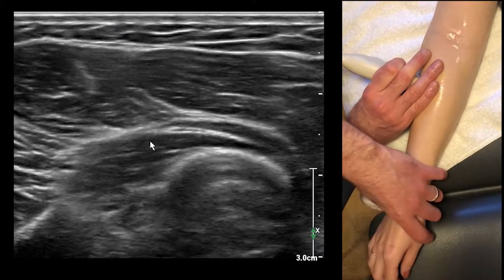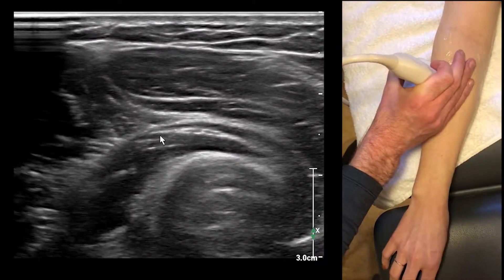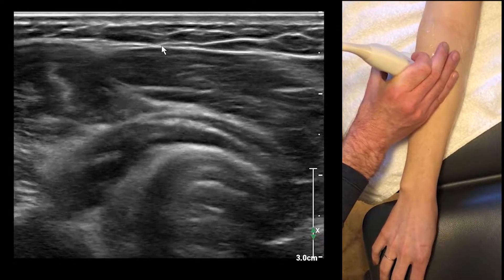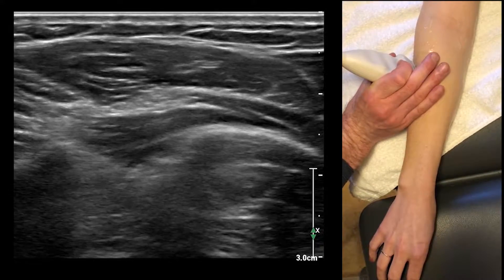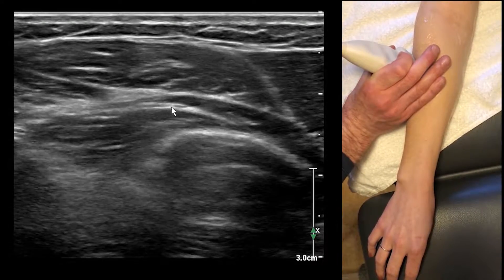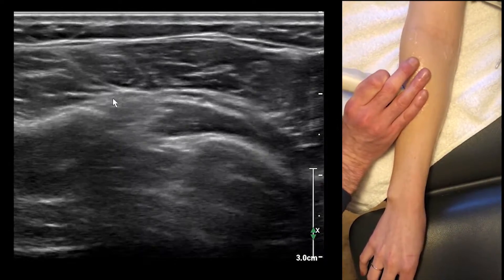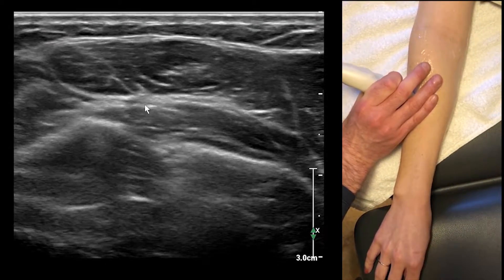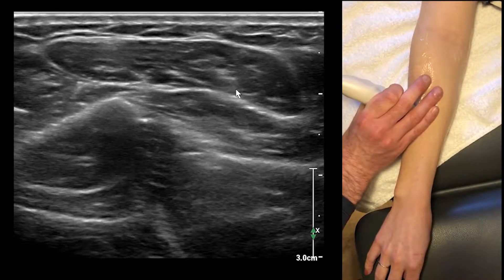We're just going to pronate. See how pronating it — pronating the wrist really helps us see these fascicles; it brings them more superficial. Now we're just going to continue to follow it along, and it's going to start branching pretty quickly. Here are a couple of fascicles, here's another fascicle, and these fascicles are going to branch off to innervate the finger extensors at this level. So you just start following these little fascicles along like that.